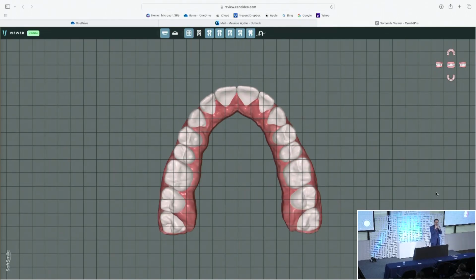Now the lowers are poking through. I've gone through 15 aligners. The upper wisdom teeth surprised us. Okay, jump into 14. That's going to be 29. A total count of 29 aligners. That's about 15 months. But in 15 months of time, I'll have every single tooth except the lower, but the lower we're coming in nice and straight.